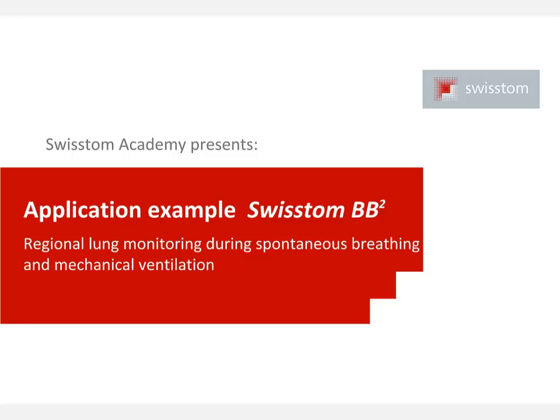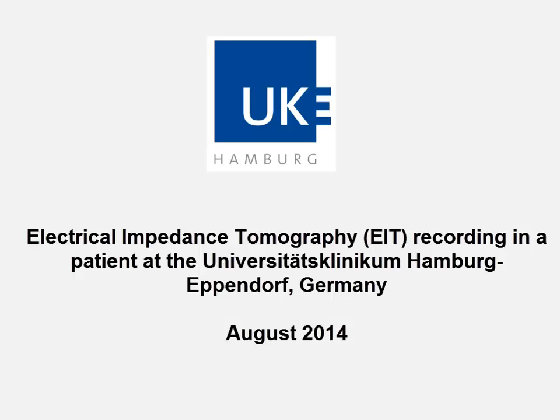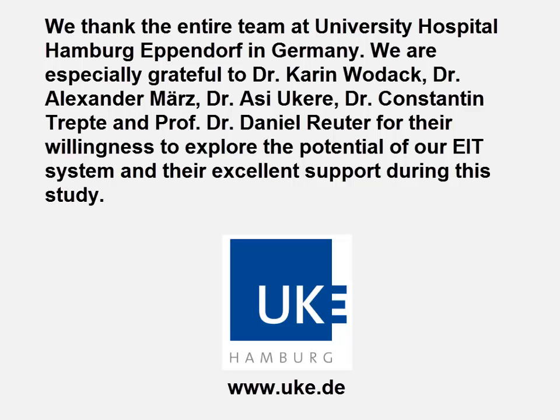In this video, we are presenting a patient undergoing robot-assisted radical prostatectomy while his lung function was monitored by electrical impedance tomography, EIT. The recordings were performed at the University Hospital Hamburg-Eppendorf, Germany. We thank the entire team of Professor Reuter for their willingness to explore with us the potential of electrical impedance tomography in this field of application.